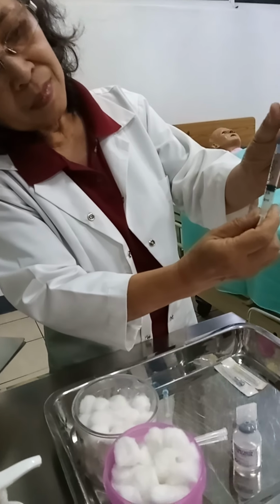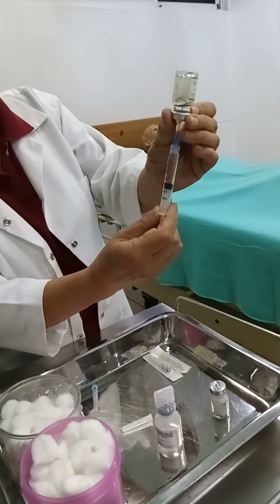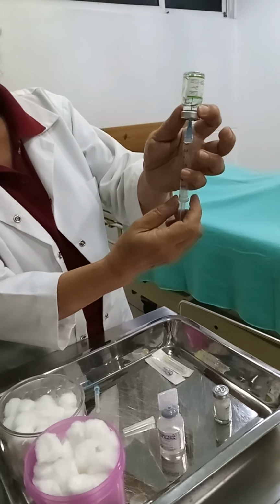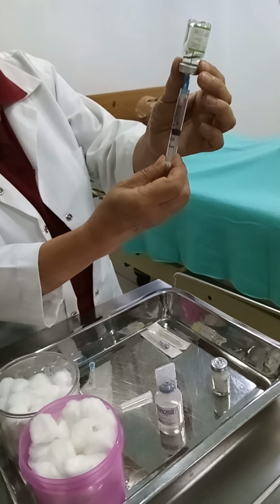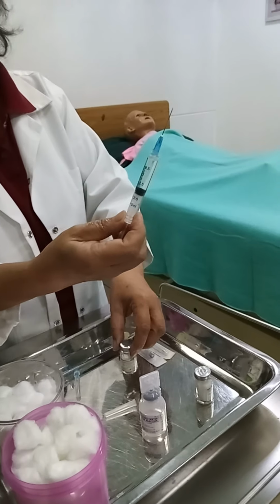When the desired amount has been obtained, position the needle into the vial's airspace. Tap the side of the syringe to dislodge any air bubbles and eject the air into the vial. Remove the needle from the vial by pulling back on the barrel of the syringe.